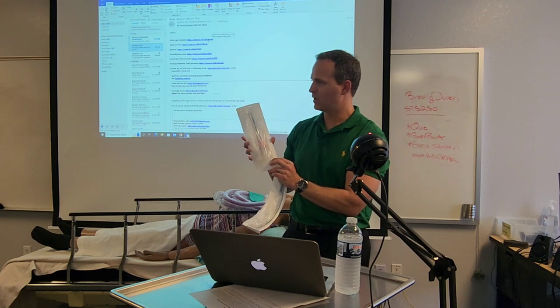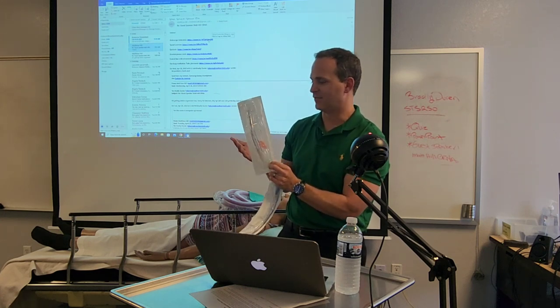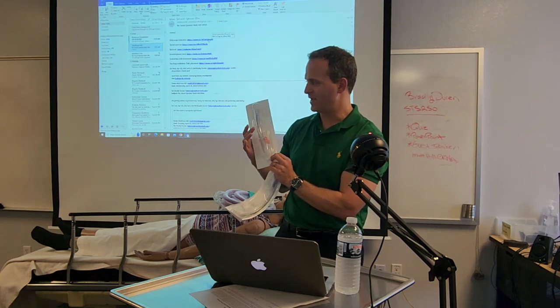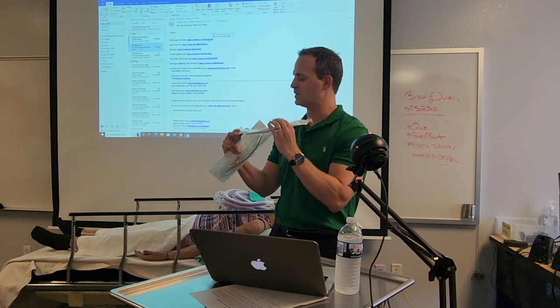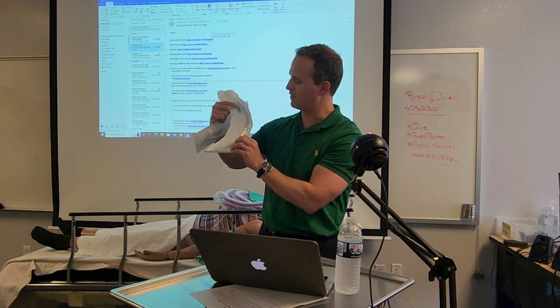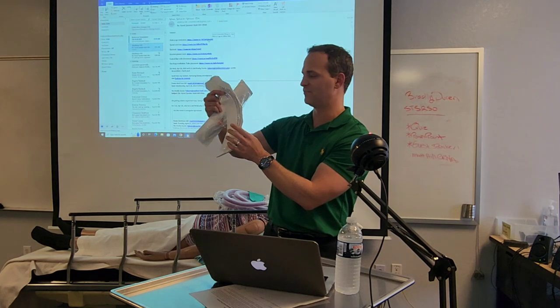If you're worried about someone coming in for surgery who ate, let's say within like an 8-hour time frame, this would not provide the best seal in the trachea. I would definitely use this, because we would use this little bulb right here to inject air, and this cuff would expand in the trachea, providing a great seal.